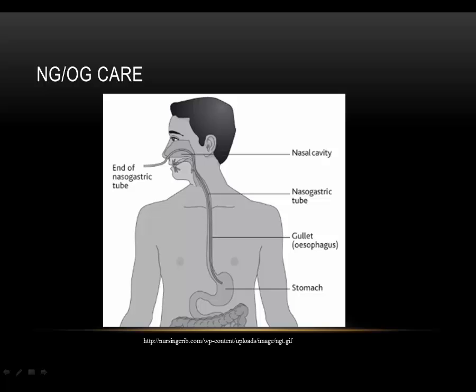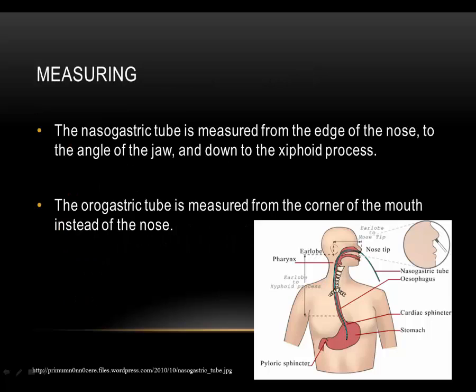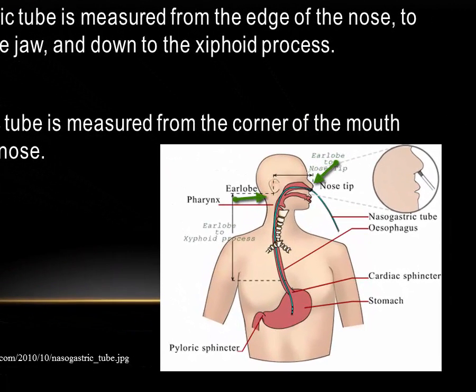Nasogastric and orogastric tube care. The main purpose of placing a gastric tube is to remove air or other contents from the esophagus and stomach safely. They can also be used to administer meds and food. When measuring, measure the nasogastric tube from the corner of the nose to the angle of the jaw to the xiphoid process. The orogastric tube is measured in the same fashion, except your starting point is the corner of the mouth.